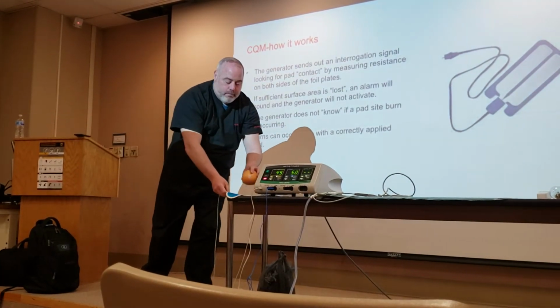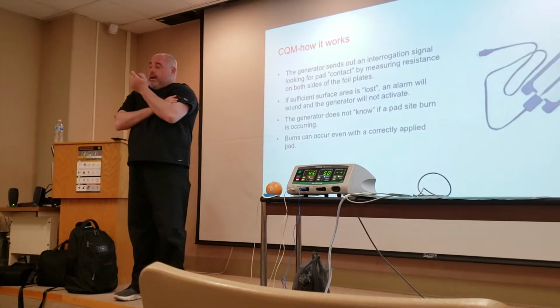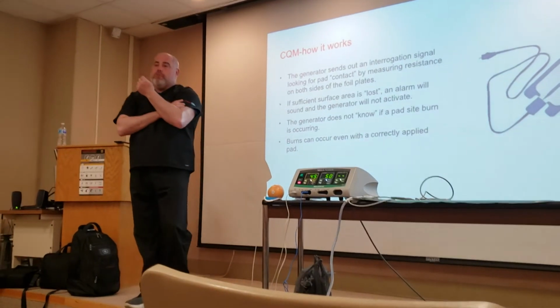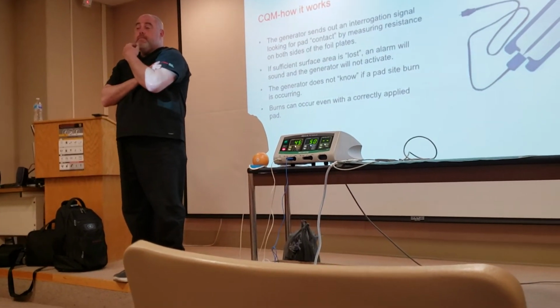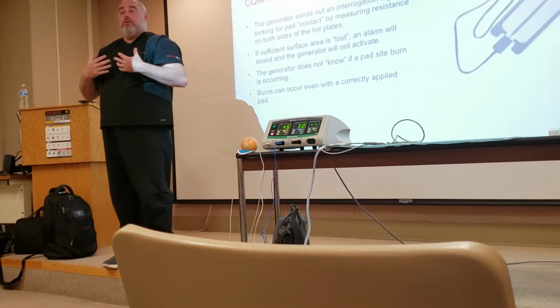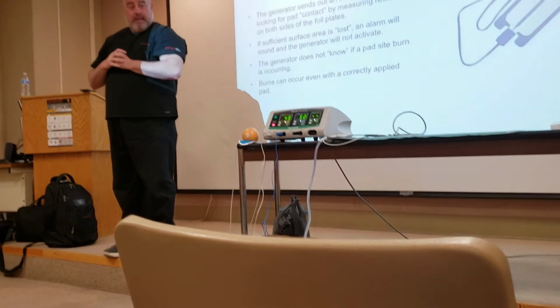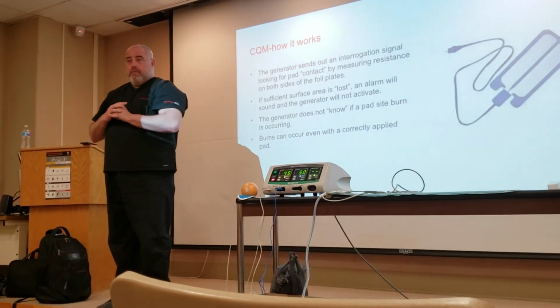Any questions on that? If your patient is covered in tattoos and you have to place the pad over one, what are the risks associated with that? Great question. So what are tattoos technically? Scar tissue. Why don't you put a Bovie pad, a return pad, over an implant? Impedance. Is it the non-conductive implant? It's non-conductive, but it's the scar tissue. So the same thing, if you have tattoos, you want to avoid them. Tattoos are scar tissue. If they're older tattoos, I believe they might have a metallic substance in them, right? So you should avoid tattoos.